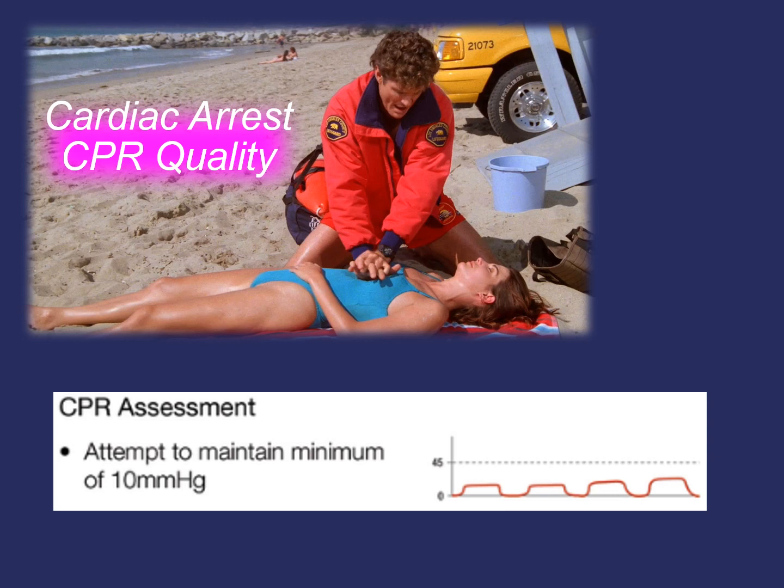Discontinuation can be one of the most difficult decisions a paramedic can make, but there are a number of what-ifs that we're plagued with. When paramedics utilize end-tidal CO2, we have one more supporting factor when it comes to making that decision of discontinuing resuscitation. Data has shown that when paramedics are performing high-quality CPR, an advanced airway is in place, and the end-tidal CO2 reading is persistently below 10 millimeters of mercury after 20 minutes of resuscitation, this is an indication that discontinuation of resuscitation should occur. The end-tidal CO2 remaining low despite any attempts to correct is telling us that there isn't effective perfusion to any organs.